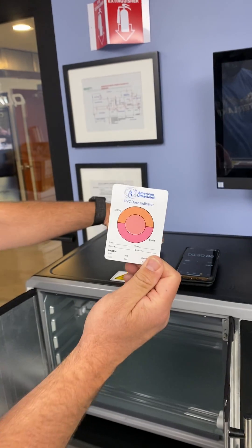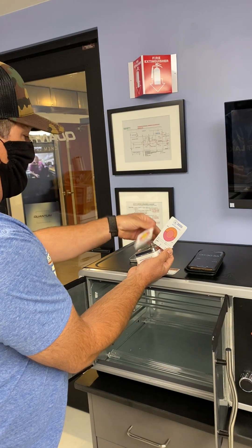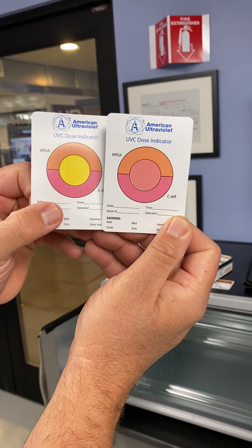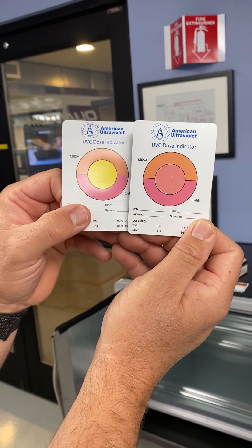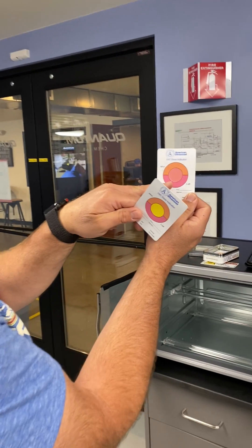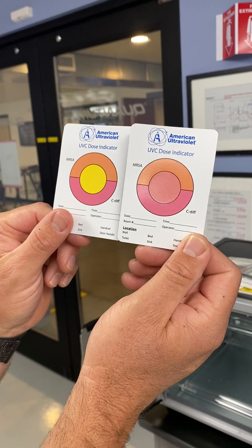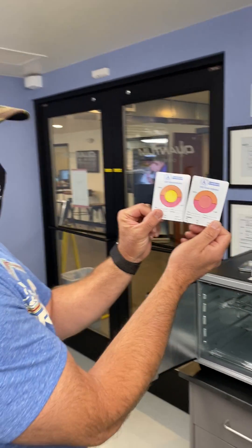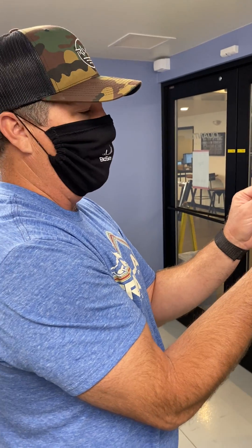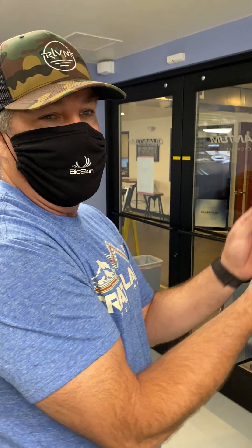Let me show you the original card, just to give a comparison. It starts out yellow. This is just like checking the pH in your pool — when it turns the color that matches, that's how much energy you've given to inactivate the different bacteria and viruses. It's a very handy tool. This is good for calibration, but it's also cool to demonstrate — very easy to see what it takes to inactivate the coronavirus.